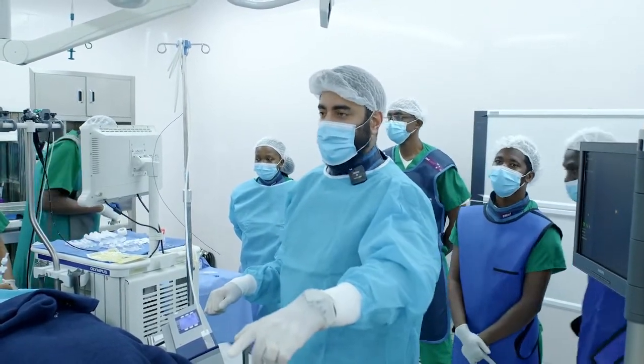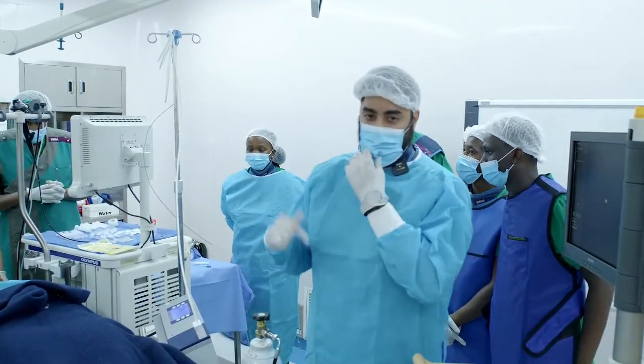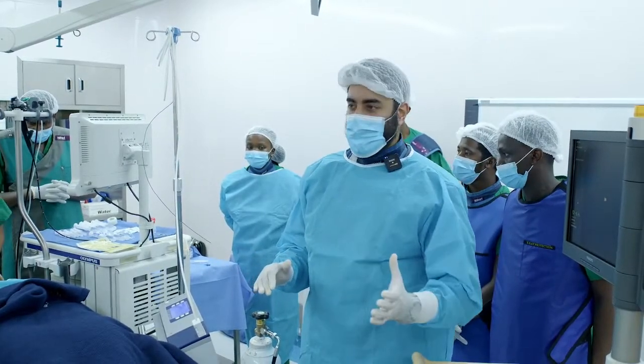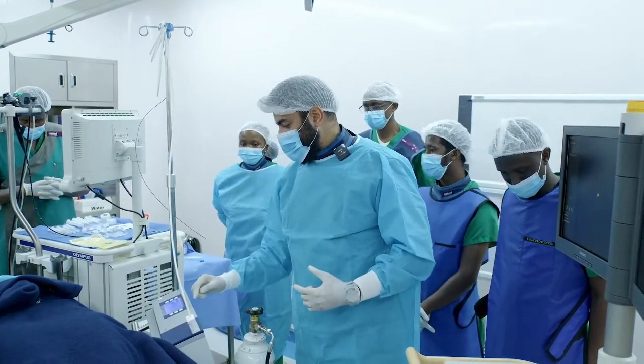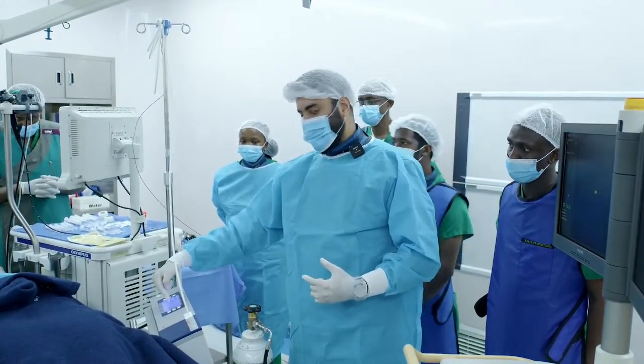Our fluoroscopy machine is there. We're going to set it up immediately now. We do all cryos, at least in this hospital, with fluoroscopy. We try as much as possible not to do it without. This is the cryo machine. It's the Erbe Cryo 2. It is coded to the probe, so when you put the probe in it, the serial number comes on the screen.